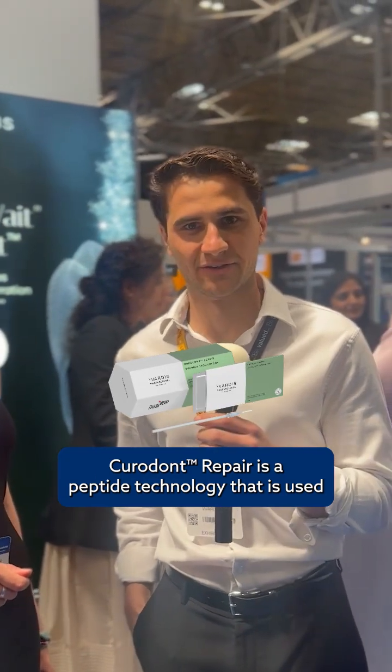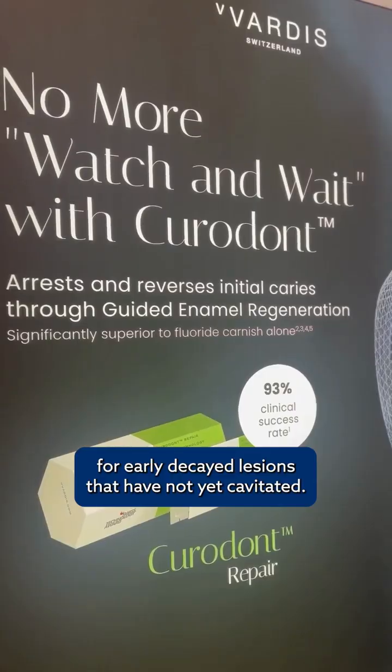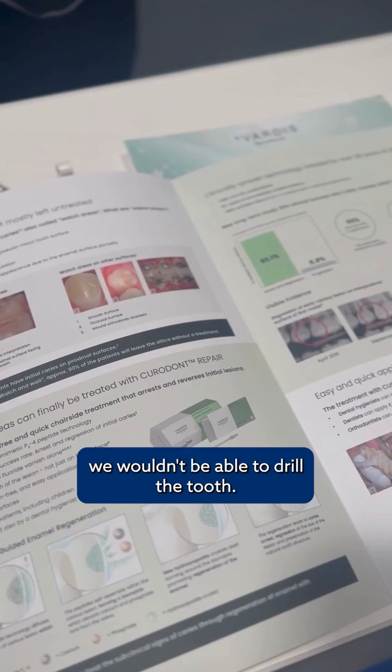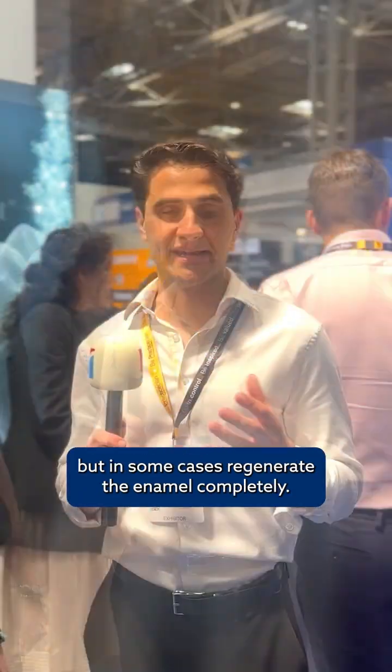Curridon Repair is a peptide technology used for early decayed lesions that have not yet cavitated. These are watch-and-wait areas where in the past dentists wouldn't be able to drill the tooth — it's too soon to drill — but it's something we can now offer a patient to not just arrest the decay, but in some cases regenerate the enamel completely.